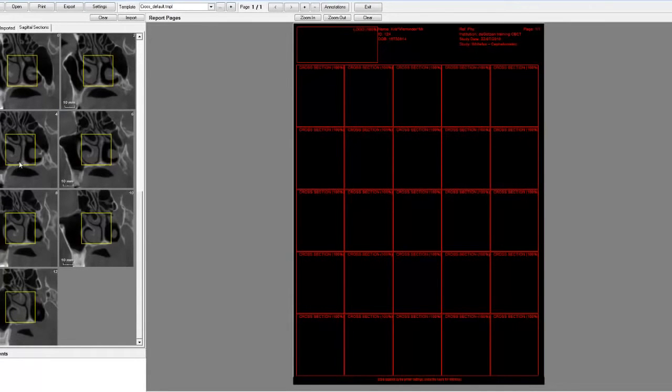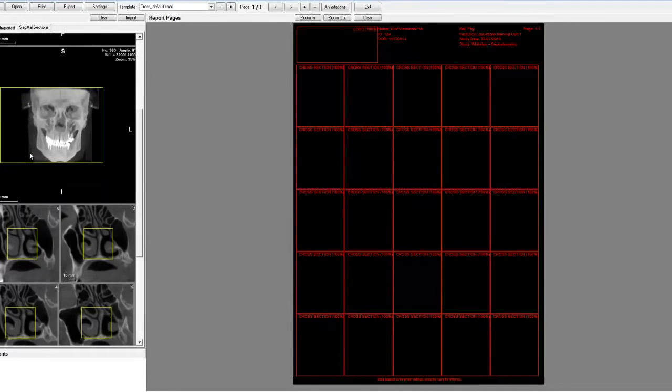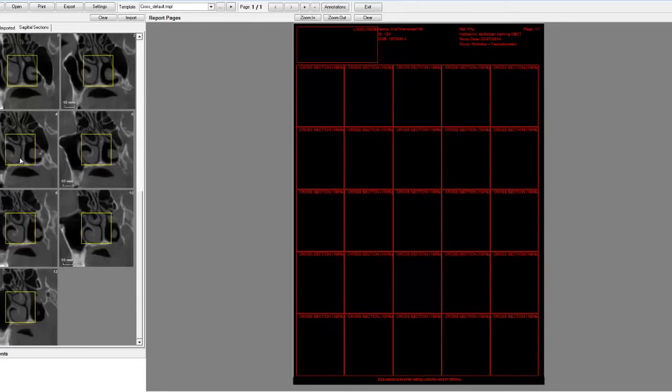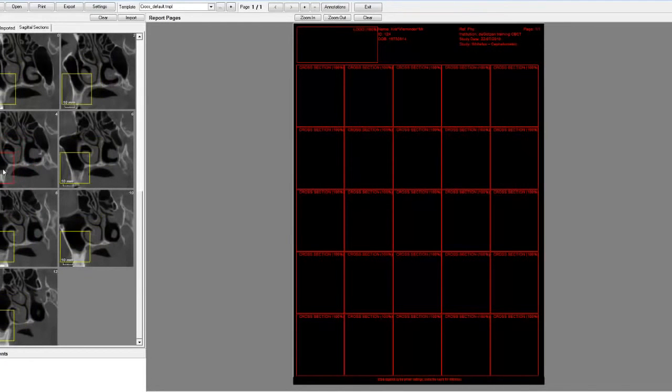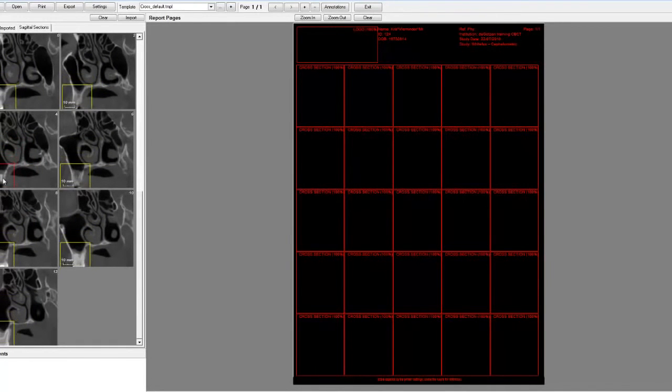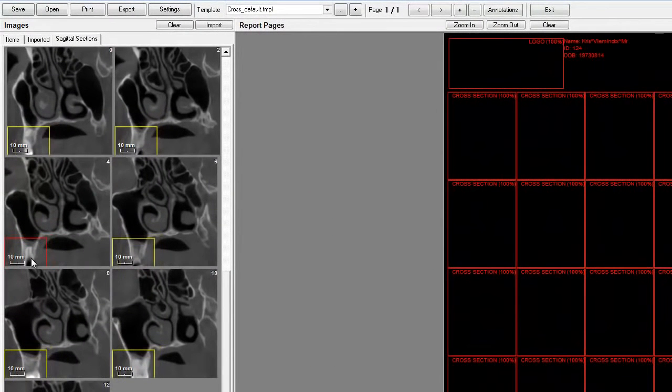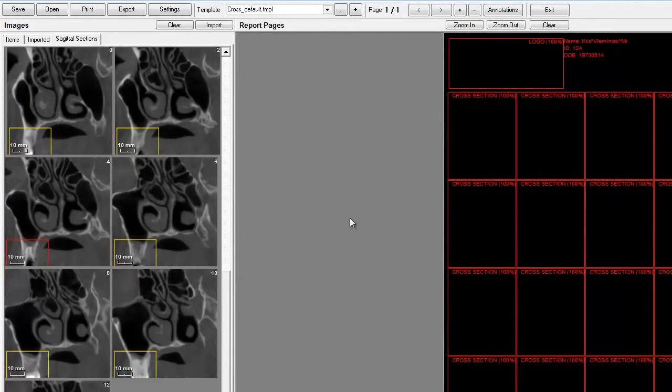And you've got all the cross section that we have been looking at and created on the last action. As you can see, you always get the full cross section. And in order to move it, you simply need to come and navigate through it. We'll see how to do that later.